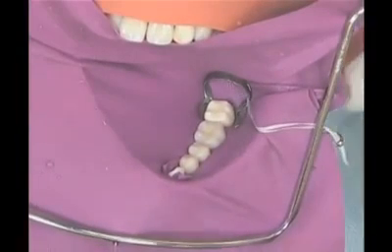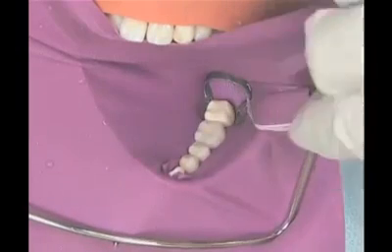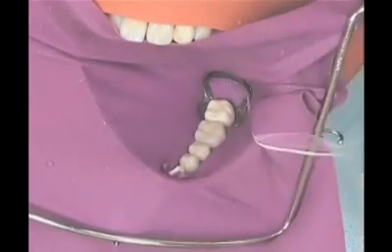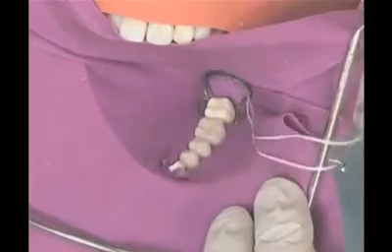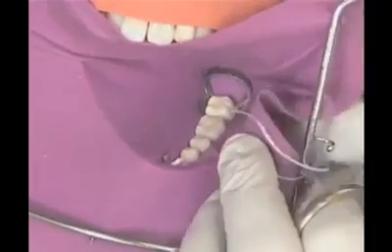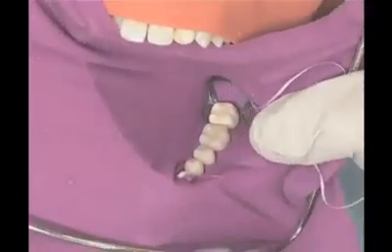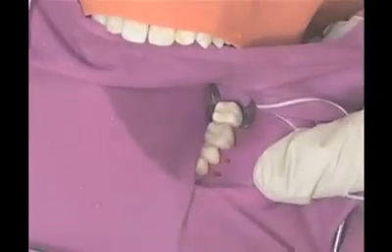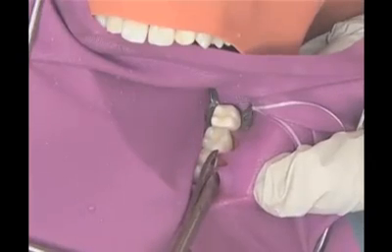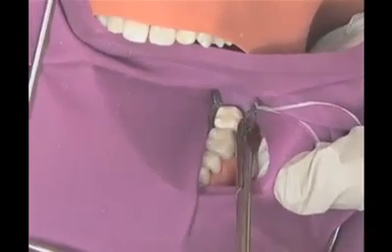When removing the dental dam, slide your finger under the dam parallel to the arch and pull outward so you are stretching the holes away from the isolated teeth. Use the crown and bridge scissors to cut from hole to hole, creating one long cut. When all septa are cut, the dam is pulled to free the rubber from the interproximal space.